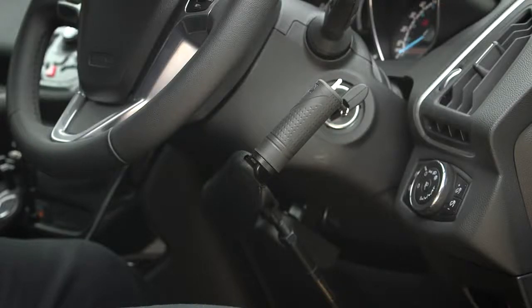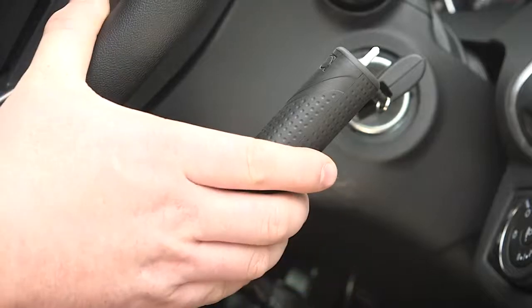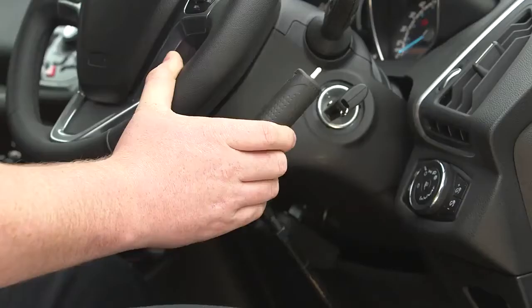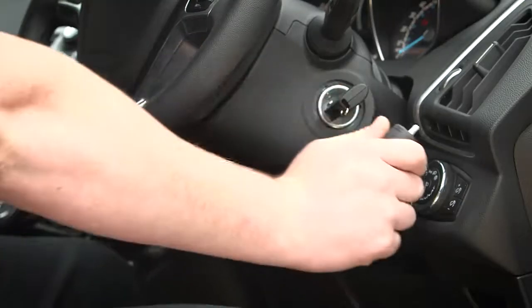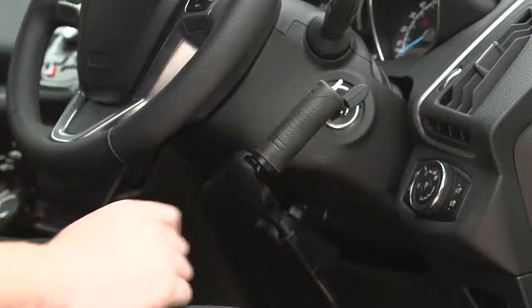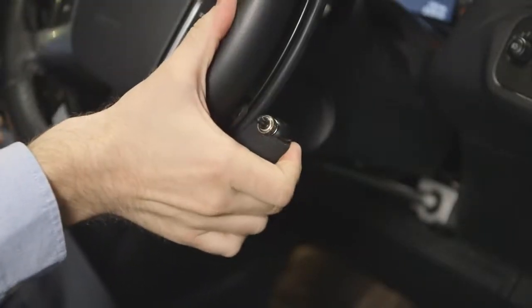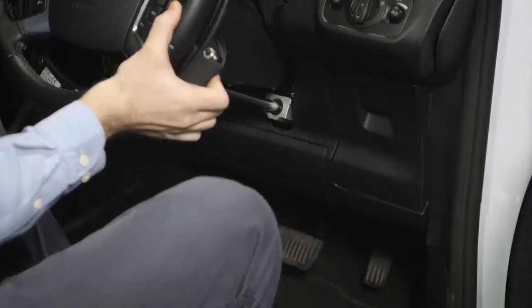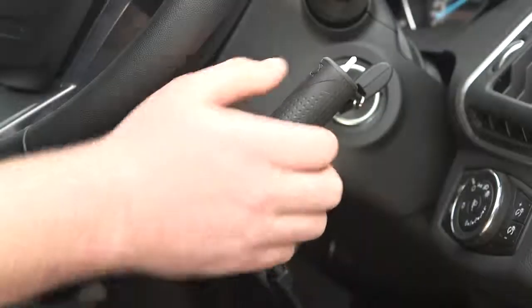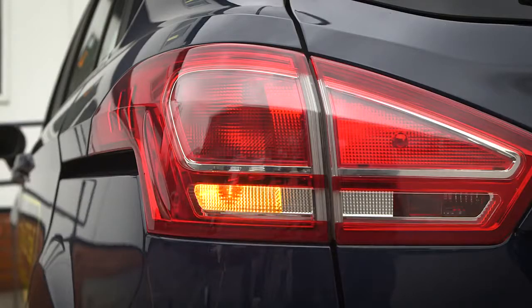A push-pull device is a good option if you find it difficult to use standard foot pedals to accelerate and brake. Simply pull the control towards you to accelerate and then push away to brake. Some push controls also come with an additional switch that allows you to operate the indicator.